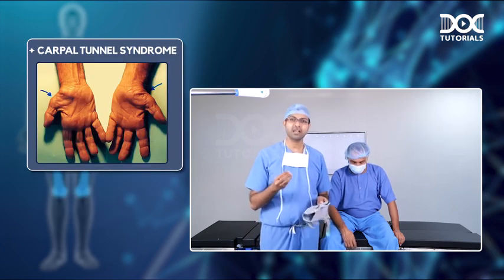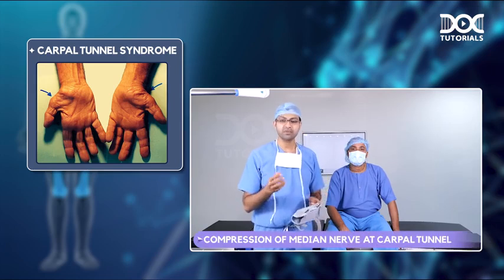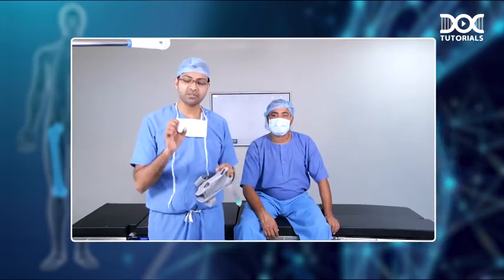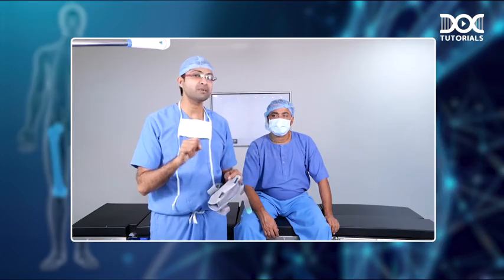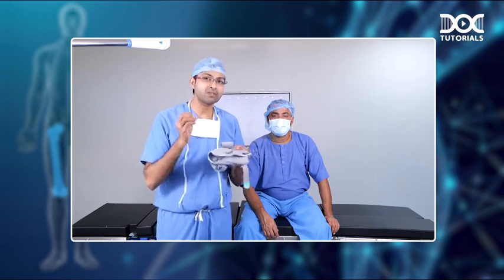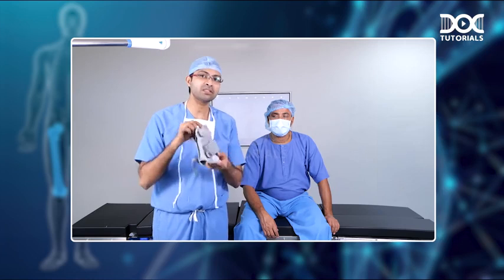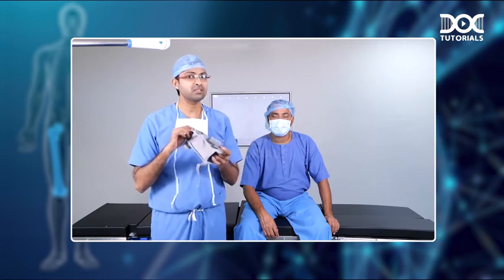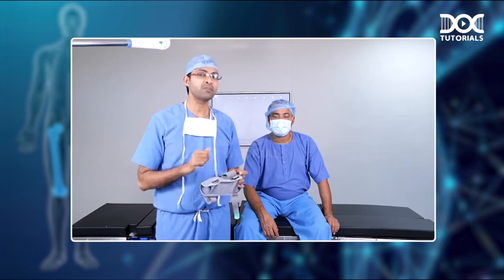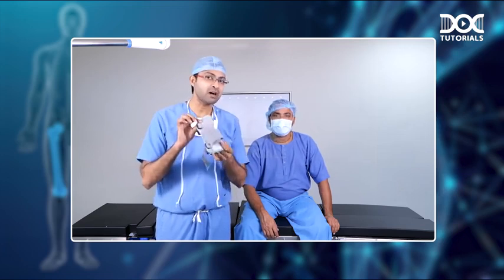It is a condition where there is compression of the median nerve at the carpal tunnel, and because of this, many patients will have severe paresthesias of the upper limb, especially during nights. Patient may not be able to sleep at night because of the severe paresthesia. So you can ask the patient to put this brace at night, and this will relieve the pressure symptoms of carpal tunnel syndrome, and the patient will have a good night's sleep. So this can be used in carpal tunnel syndrome.